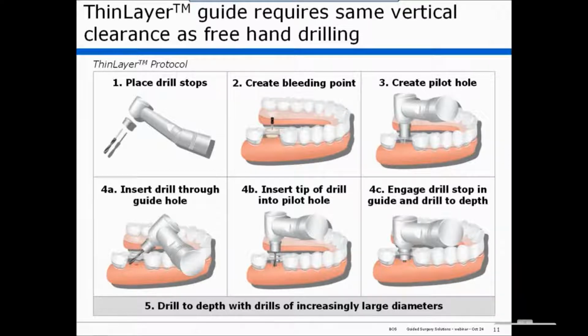So the first step would be to use an insert with an endo file or a sharp burr and create a bleeding point. And this replicates the ideal insertion point for the case. So you create a bleeding point.